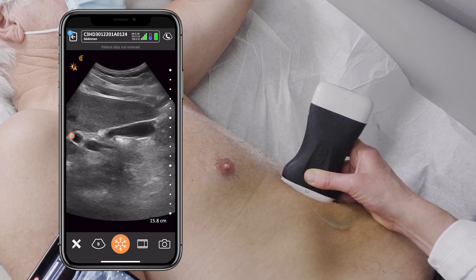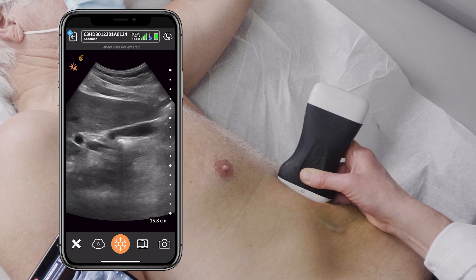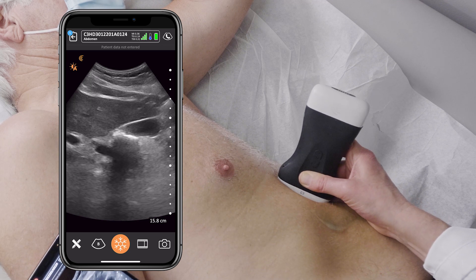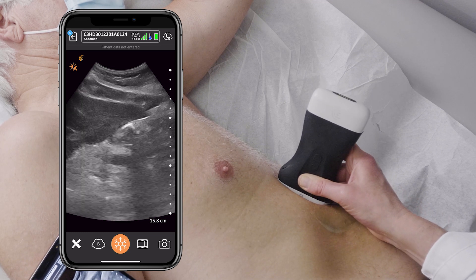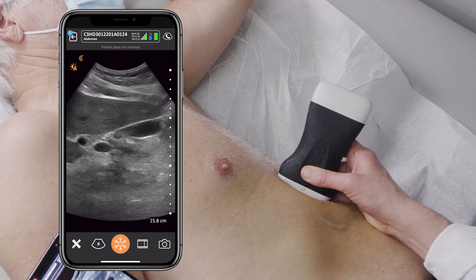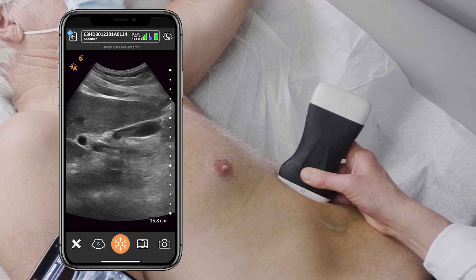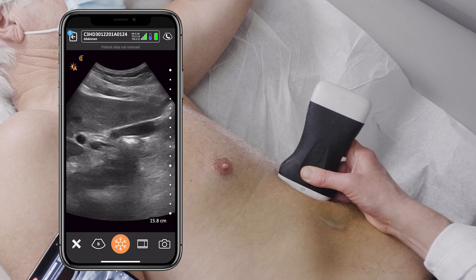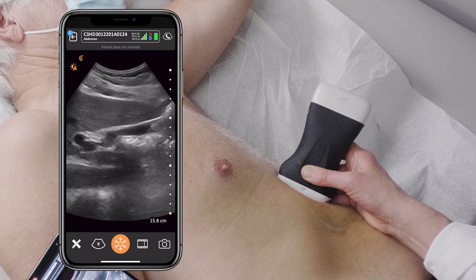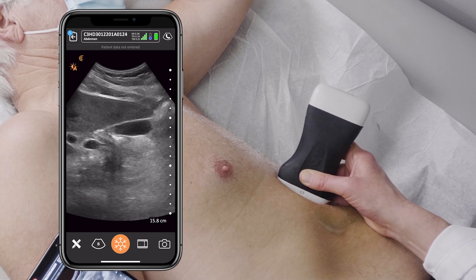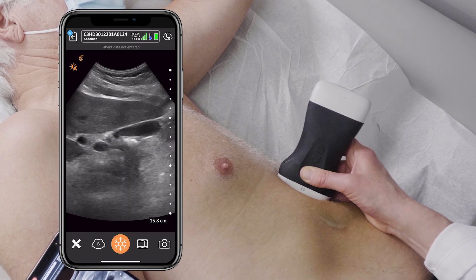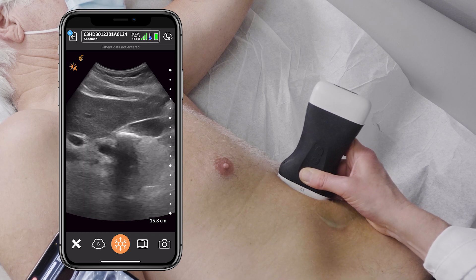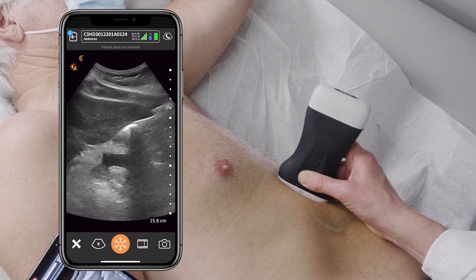Once I have the gallbladder in view, I'm going to fan through it, interrogating the entire gallbladder, particularly the neck of the gallbladder. I'm looking for stones, which are white echogenic areas that cast shadows. In this case, I see no stones.